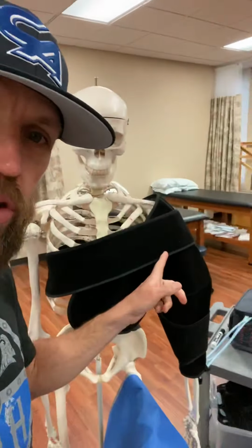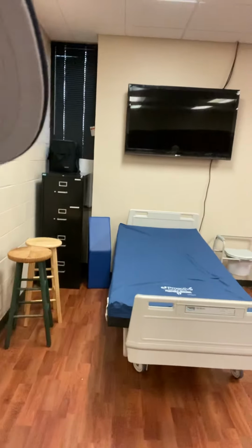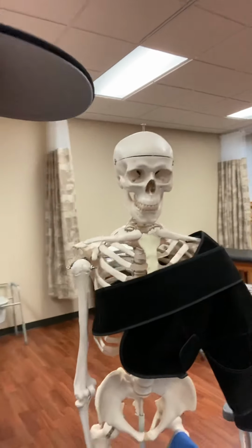That acute injury, like a sprained ankle, or maybe you just hurt your shoulder like Tony did here, or maybe you hurt your knee or your ankle, this thing right here, money, because it's going to bring in compression on top of that ice. And if you remember from class, rest, ice, compression, elevation, those are your top 4 things to do when you have an acute injury. So this machine right here does 2 of those for me, and then I can come in with a nice little elevation tool like that bolster you see over in the corner, and I can lift up a lower extremity, or I can just prop them up and really get that great holistic RICE component going.